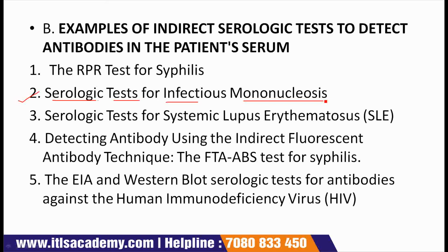The infectious mononucleosis serological test demonstrated today is a rapid qualitative test for infectious mononucleosis which uses specially treated horse erythrocytes acting as the known antigen that are highly specific for mononucleosis heterophile antibodies.